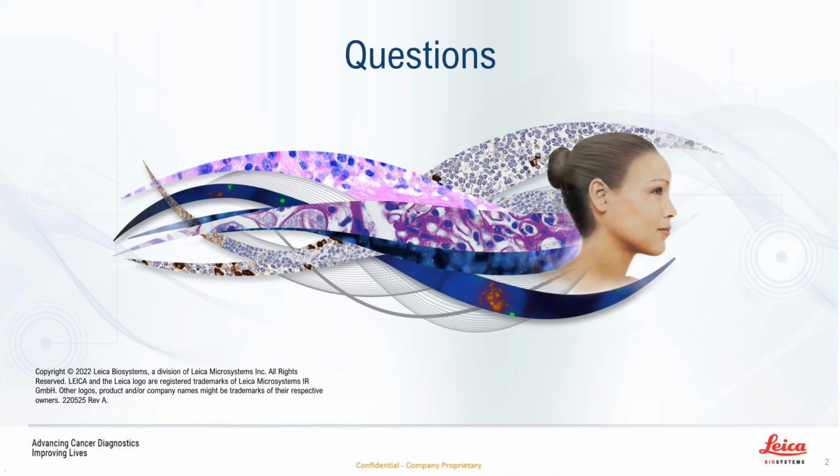I would probably look at this in a similar way to the question about cytology and fluorescence, which is: check your slides out with the scanner you're considering using. Different scanners employ different focus mechanisms and tissue detection mechanisms. So you need to ensure that the scanner will work with your samples as they're created, whether that's using glass or plastic cover slipping. It's also going to depend on the glass and the tape cover slips that you're looking at using and the specific optical properties of those.